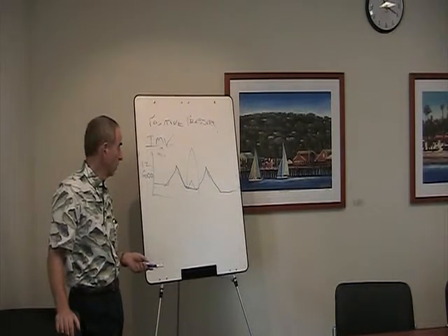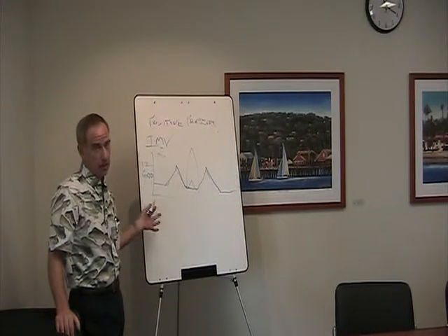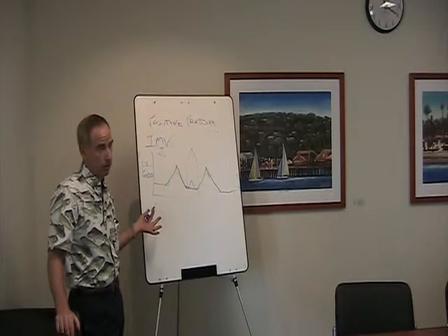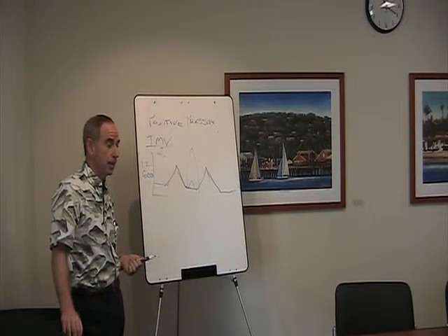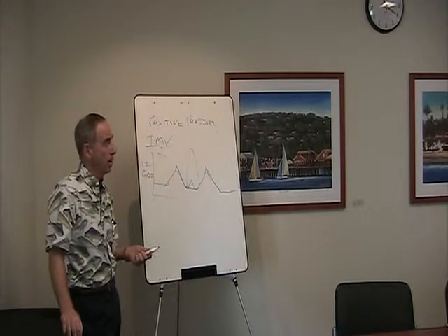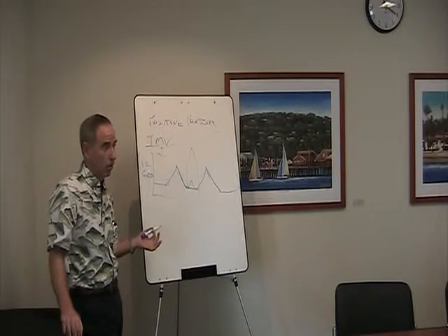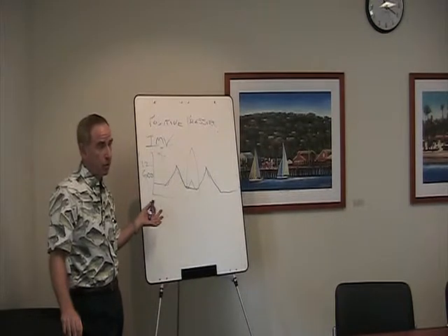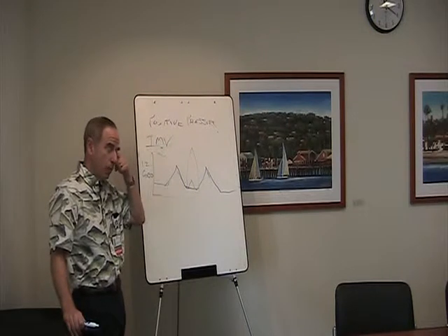So this mode of ventilation was designed as a mode of weaning. It wasn't designed as a primary mode of ventilation, just to ventilate people with. It was really designed specifically to wean patients. So how did that work? Why was there felt to be a need for that, and what was the philosophy behind it? Does anybody know? How did we wean people from assist control? If you have somebody on assist control, how do you wean that patient?